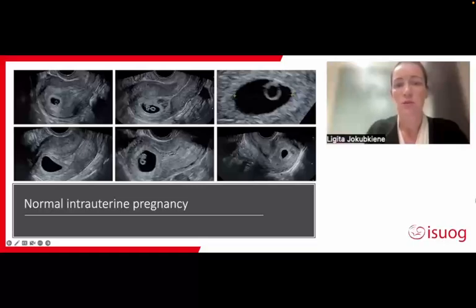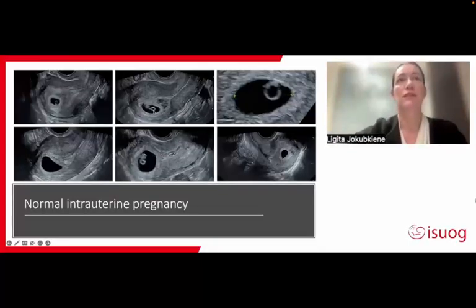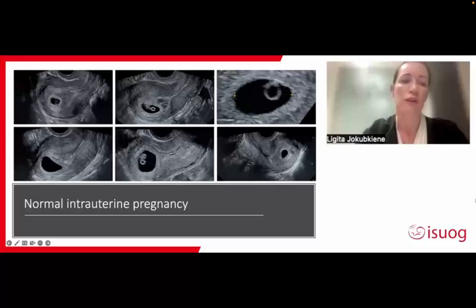Here we can also see a small embryo, and of course this is not a video, but we might also see some activity, like heart activity. Then we can also look at the yolk sac, and of course assess the location of the pregnancy, which is also very important in the assessment. So we have to locate the pregnancy in the uterus as well.